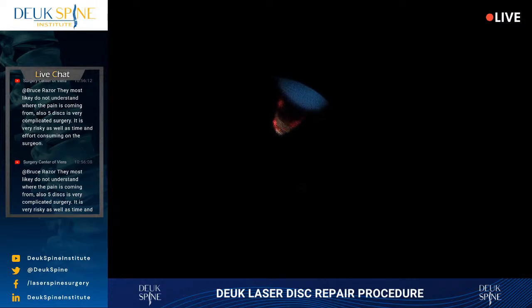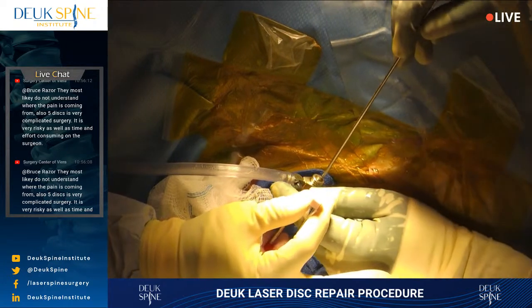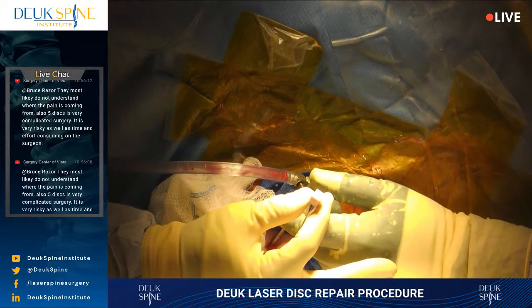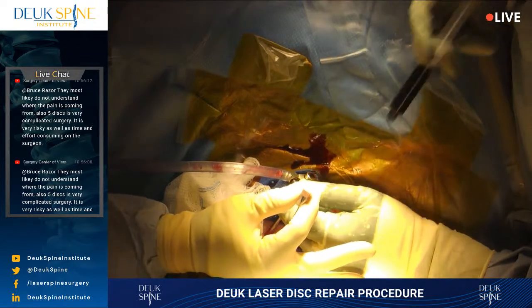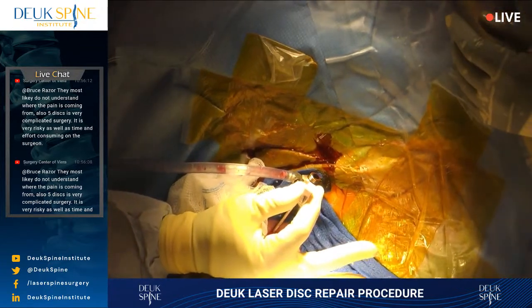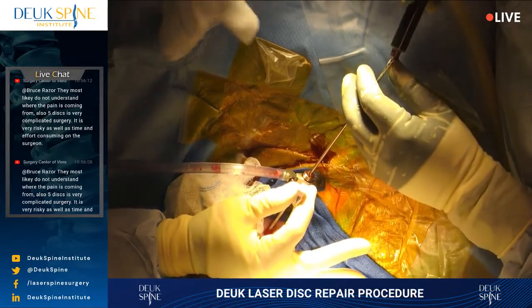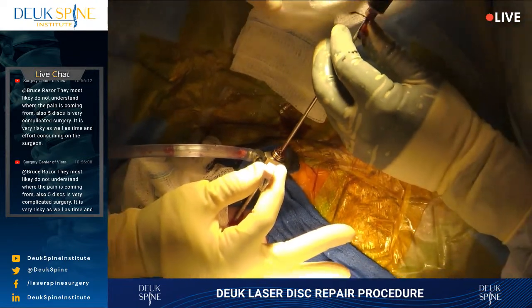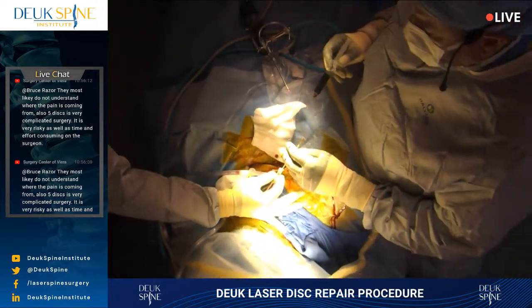Lights on, please. Let me have the dilator. That's the dilator. You gotta learn this stuff. Iodine, we have iodine. Please. Irrigation, please. Do a little antiseptic. Let me have the dilator. Wash your face. You have to, every time. You gotta step back, man. You have a needle? Let go of that, please.